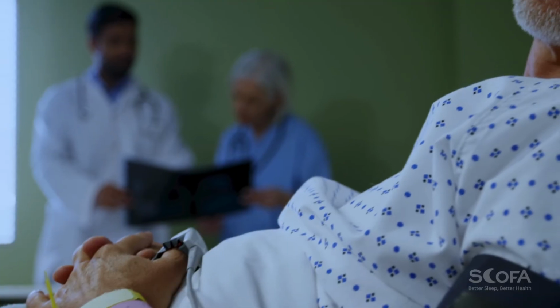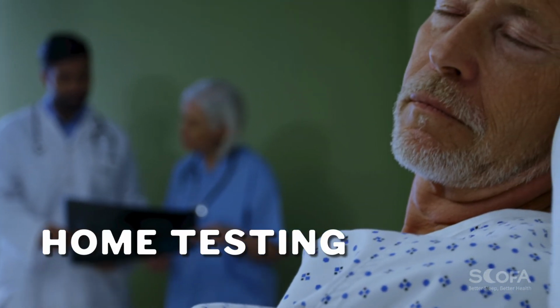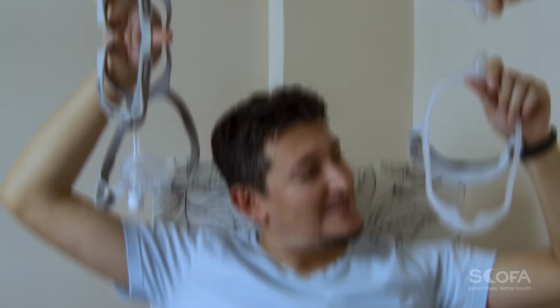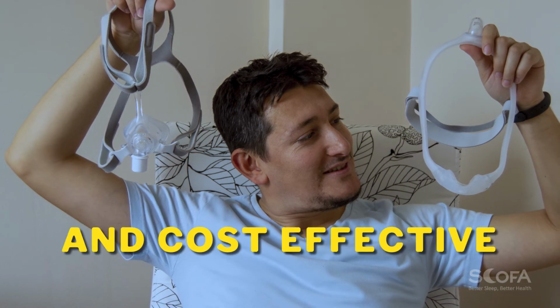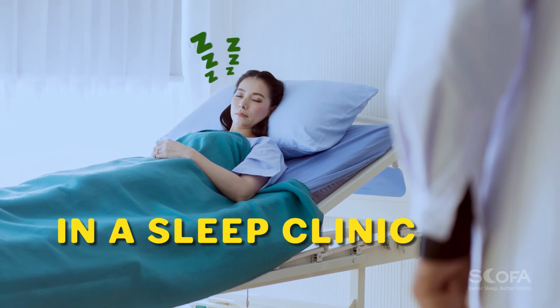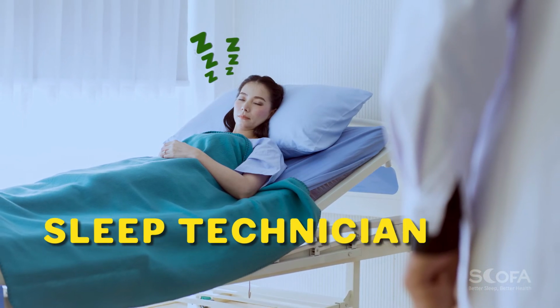4. CPAP Titration. This is a follow-up study after polysomnography or home testing. It is done at a sleep clinic, like the polysomnography, but with you wearing a CPAP mask. While home sleep apnea testing is easy and cost-effective, it's not for everyone. The test device measures fewer variables than an all-night test in a sleep clinic, providing fewer data, and it's not monitored by a sleep technician.